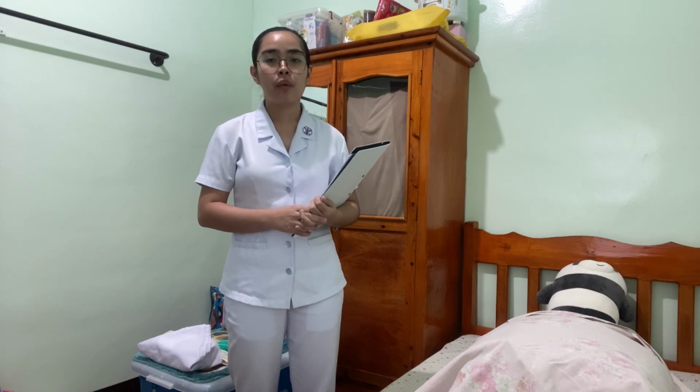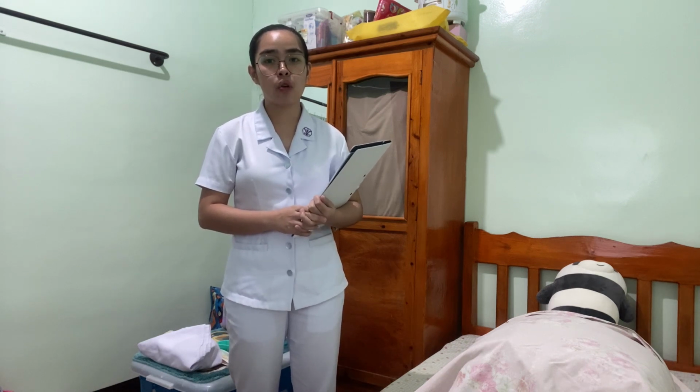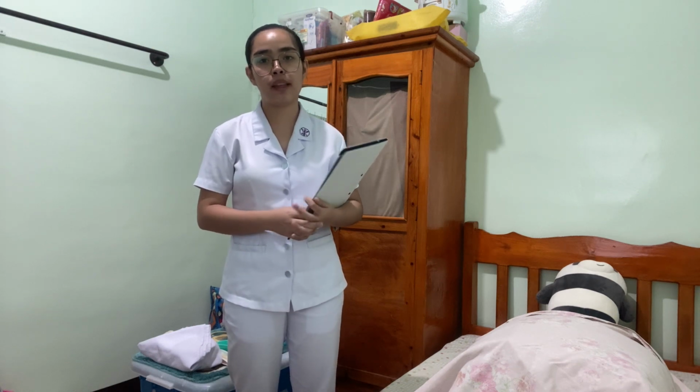So first, we have to check the doctor's order for catheterization. This is done to ensure that I have the right patient and the right procedure to be done.